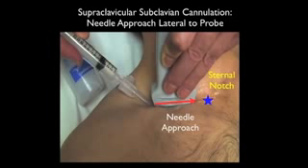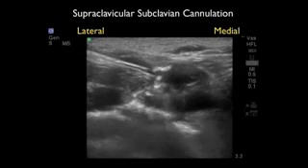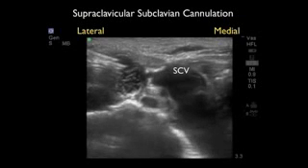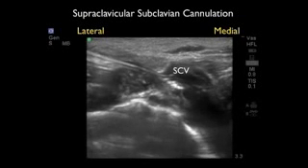Here we successfully cannulate the subclavian vein using the long axis approach under ultrasound guidance. We can see the needle coming in from lateral to medial, successfully cannulating the subclavian vein. Notice that the needle has a bright, echogenic appearance on ultrasound. We can stop the video clip and see the tip of the needle centered within the subclavian vein. Depth markers show the subclavian vein at about one to two centimeters, and we need to keep the needle tip relatively superficial as the dome of the lung is relatively close.